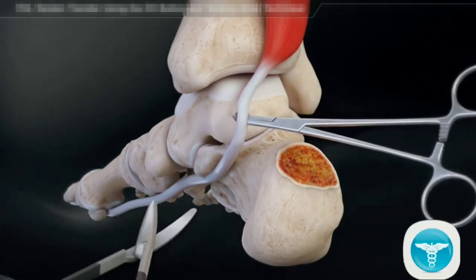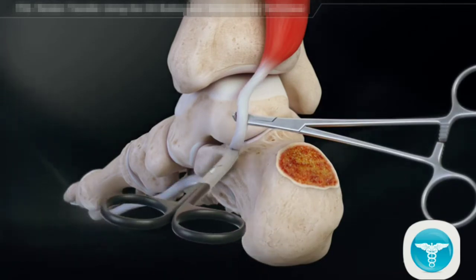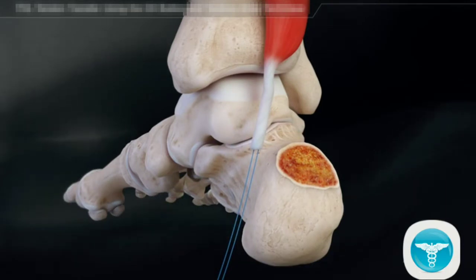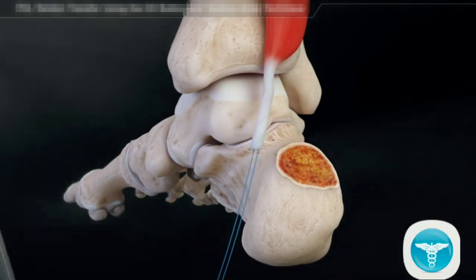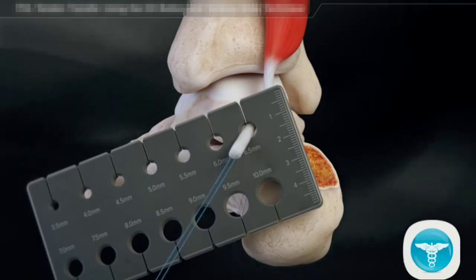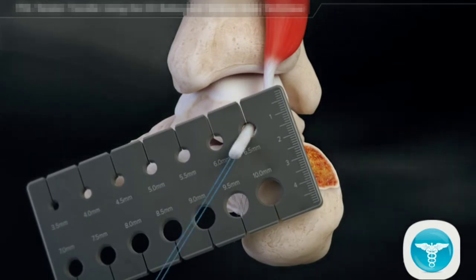Retract the neurovascular bundle and expose the tendon. Then cut the FHL as distal as possible. Place a traction stitch through the tendon using a number 2 fiber loop suture. Size the tendon through the tenodesis graft sizer. Based on the tendon diameter, open either the 6.25 mm or 7 mm FHL implant system.